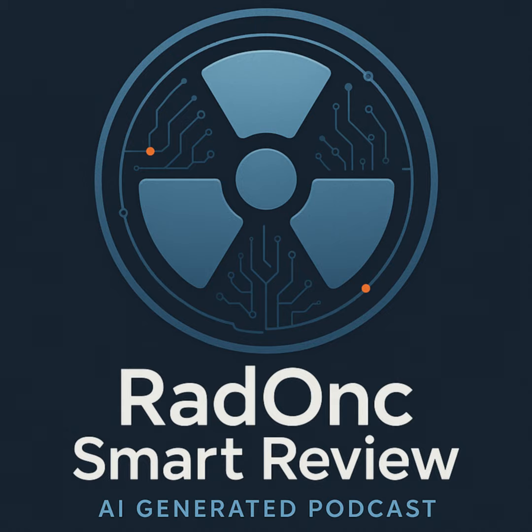Precisely. The header stores crucial technical parameters. For a CT scan, you'll find the kVp, the mAs settings. Kilovolt peak and milliampere-seconds. Yep. For an MRI, it'll detail the pulse sequence parameters, the TR, the TE, things we'll get into later. These aren't just for curiosity. They affect image quality and sometimes how you process the image.